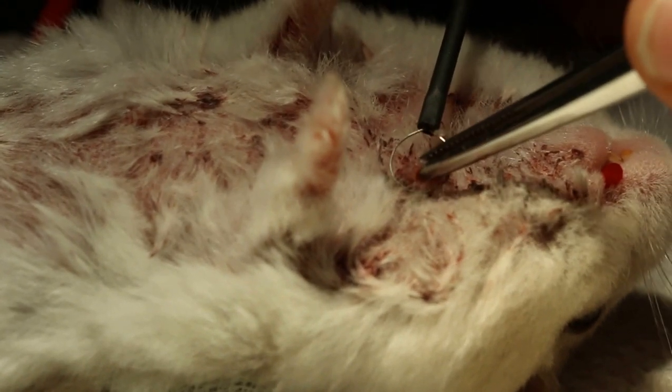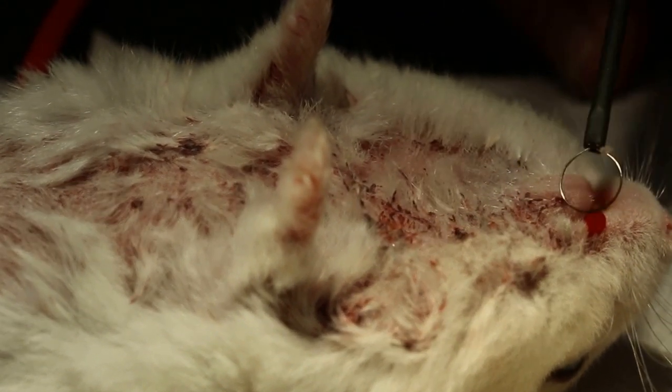So I cut here, this is the demonstration, so this wound will heal.